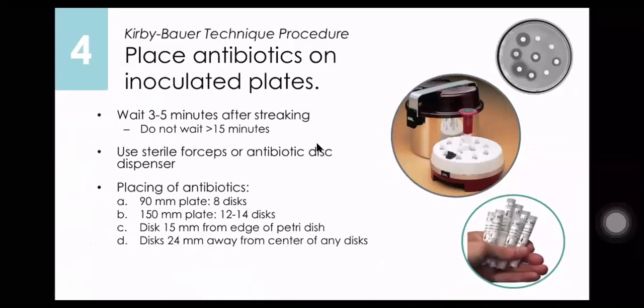Did you get it? Sorry if I confused you. Did you understand false sensitive or false susceptible and false resistant? Yes. Okay, sure? Just remember, guys: false resistant, delay in disc application; and false sensitive or susceptibility, if there is delay in incubation.